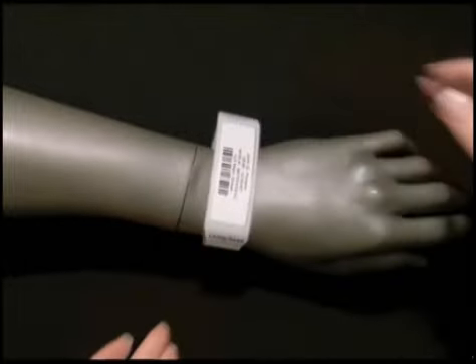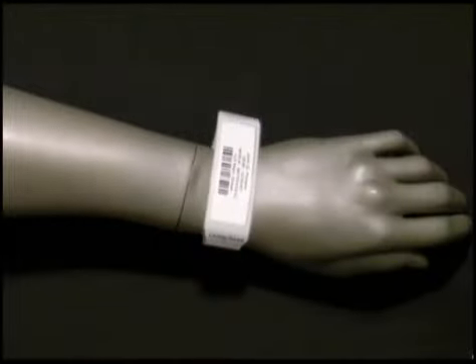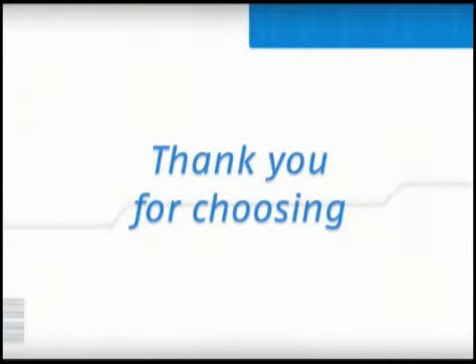This completes the assembly of the LB2 Adult L3S wristband with extender. Thank you for choosing LaserBand.